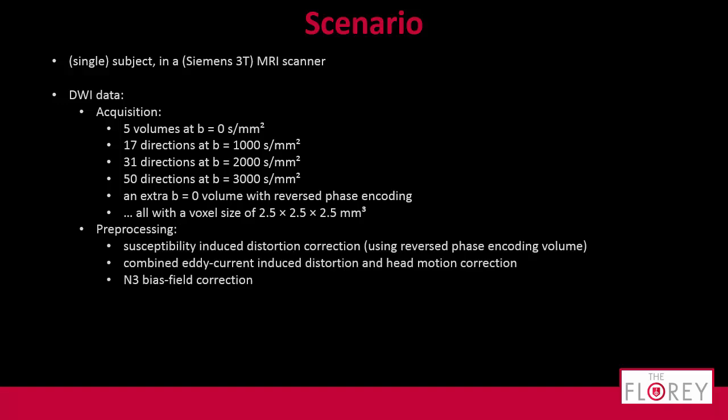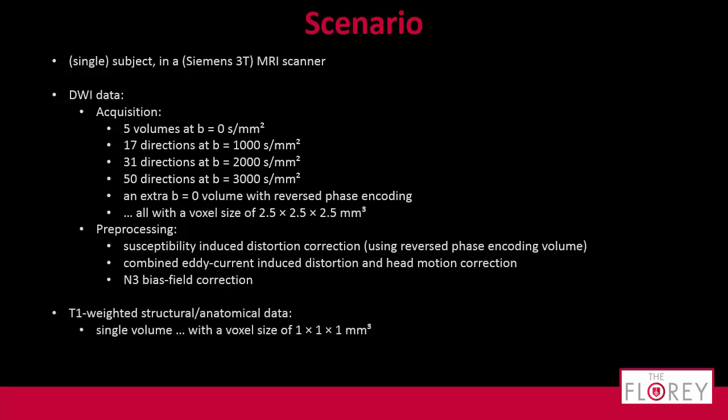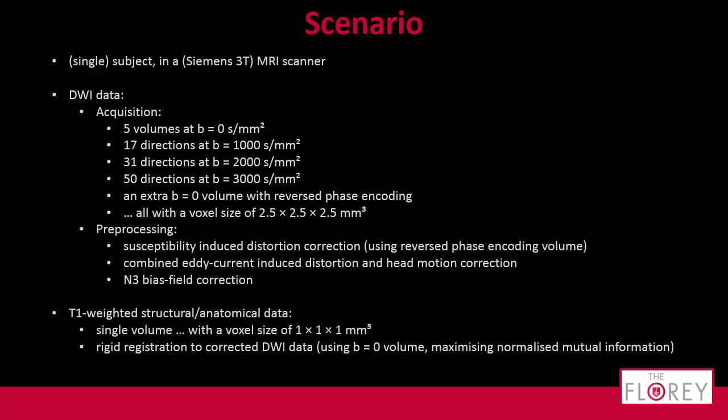Nice pre-processing pipeline, highly recommended as well. I'll need it, so please do so. T1 weighted volume, just a single one, very fast to acquire, very easy, but a better resolution. That's good. And we'll match it to the DWI data as well, of course.